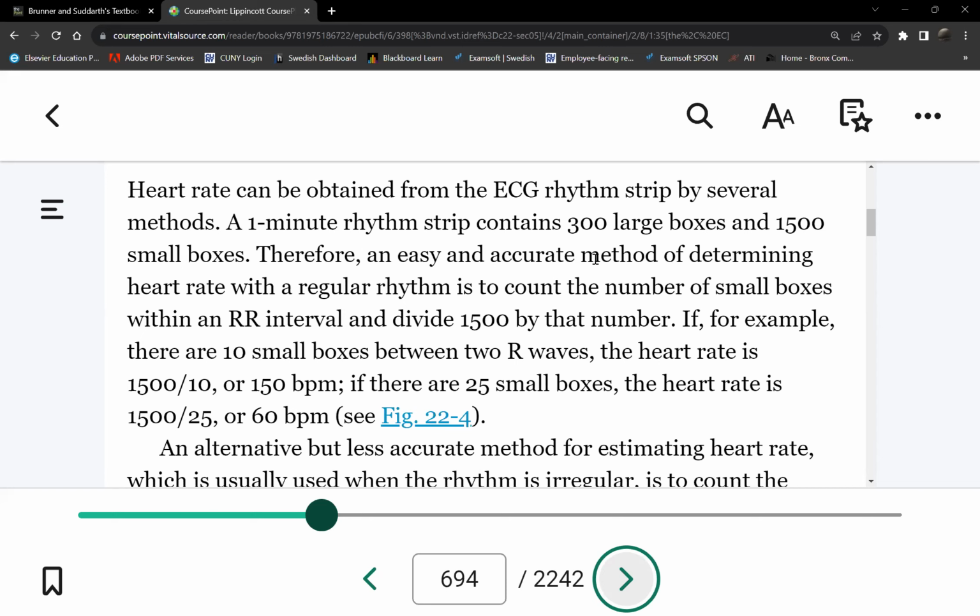It's an estimated heart rate. We only call it estimated because the only accurate heart rate would be a 1-minute strip, which again is very impractical to do. So we only do an estimated heart rate, using how many seconds? 6 seconds. All the strips you'll see from here forth are 6-second strips. On your quiz next week, you'll see 6-second strips, and if we ask how much, you'll have to multiply by 10? Yes. Okay.